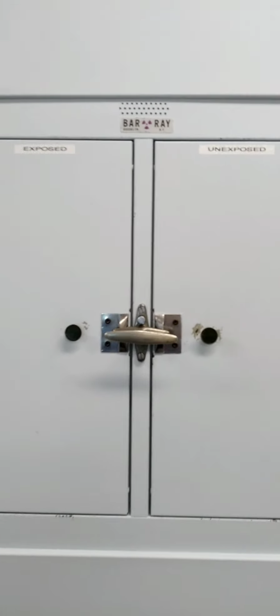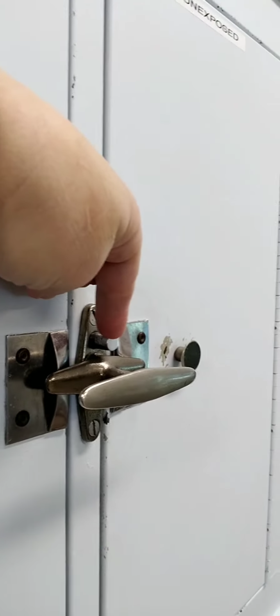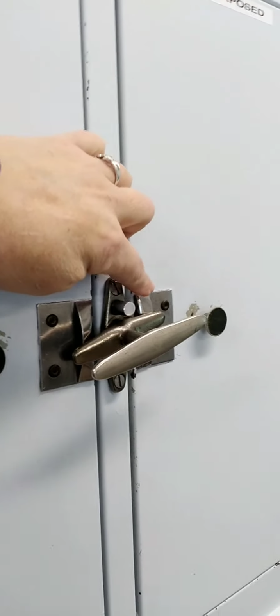Continuing on the wall, these doors here are called the pass-through box. The pass-through box gives you access to your x-ray cassettes. So if I were to open that, there is a little peg that's sticking out. I'm not sure if you can see it. It's right here. To turn the handles, I have to actually push the peg in first. When I push that in, you can see I have two sides.